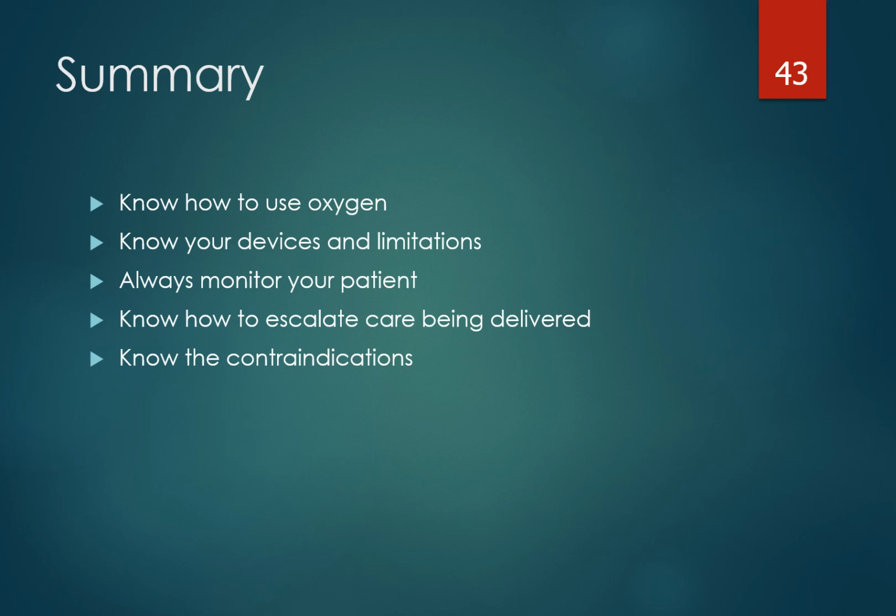Well, we're finally here. This is our summary slide. I want to thank you for joining this presentation. I want you to know some key points. Know how to use oxygen. It's a drug, and you don't want to use too much oxygen because of toxicity. Know your devices and their limitations. Certain devices cannot deliver 100% FiO2. They can't even deliver 40% FiO2. So learn that each particular device you use has limitations and it has uses.